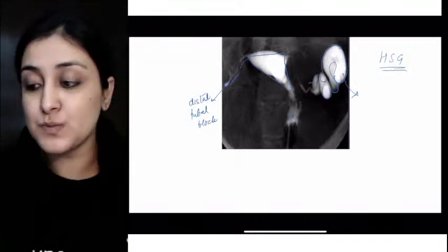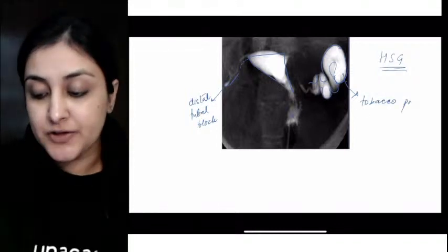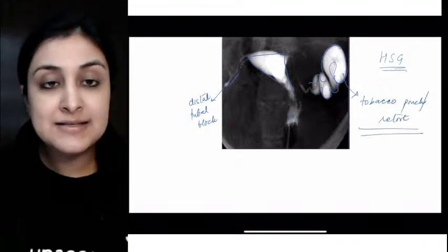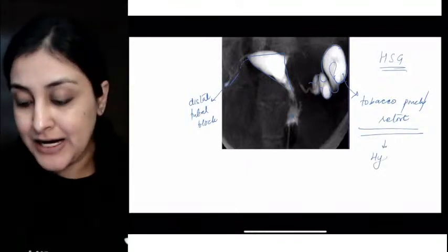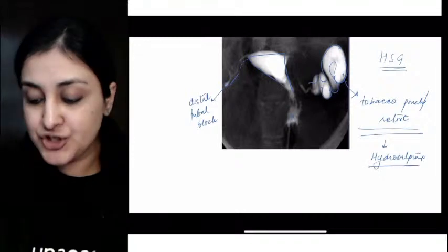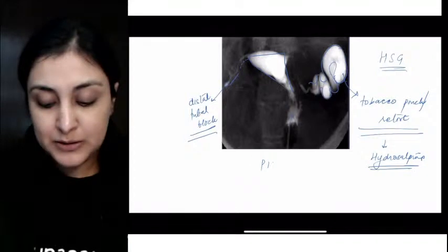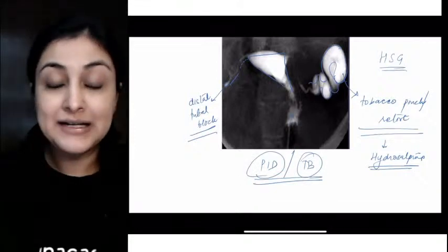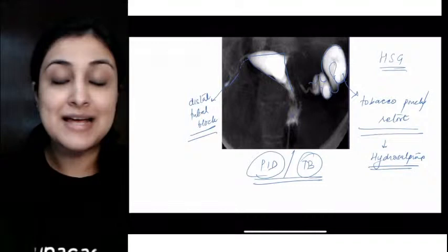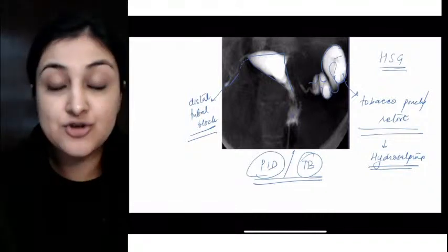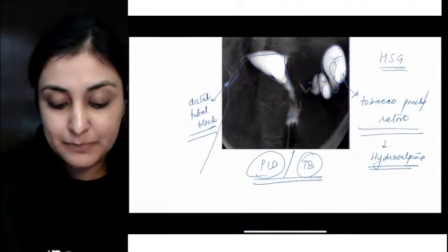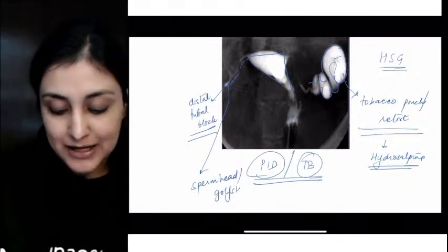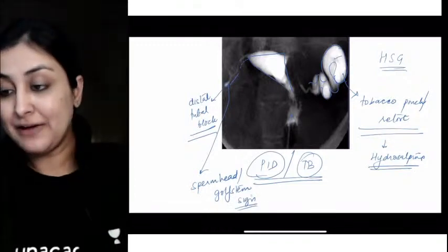Both of these conditions are seen with what disease? This can be seen with PID, pelvic inflammatory disease, or it can be seen with tuberculosis more commonly in our country. TB and PID are the two possibilities that we consider when there are bilateral tubal blocks, there is hydrosalpinx, tubal block here. Some people think it looks like a sperm, sperm head appearance, golf club appearance. Such signs will always come your way. Is this clear?